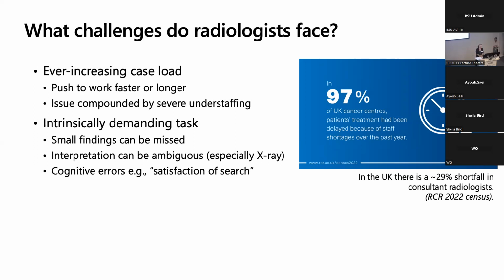There are known cognitive errors. This has been studied a lot in radiology reporting, where, for example, once you found something, you may stop looking for other things, maybe not consciously, but this can happen. So the result is there can be errors, patient care can be delayed, and there can be burnout in the workforce. Obviously, we would like to help.